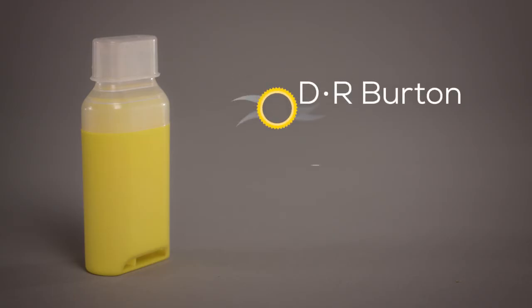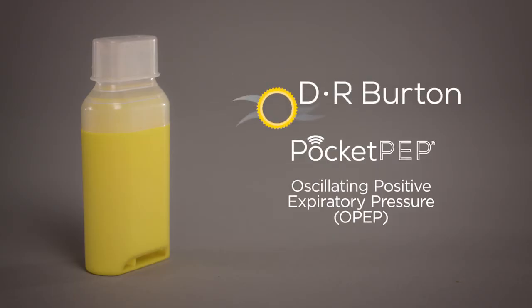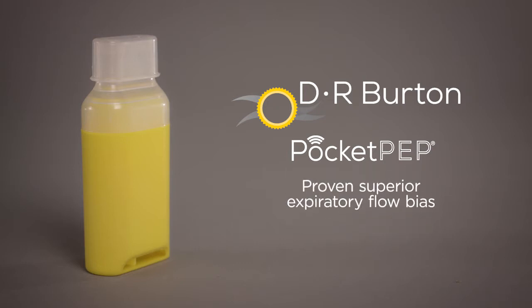The DR Burton Pocket PEP is an oscillating positive expiratory pressure, or OPEP, device which aids to loosen and remove bronchial secretions. It has proven superior expiratory flow bias for superior airway clearance.